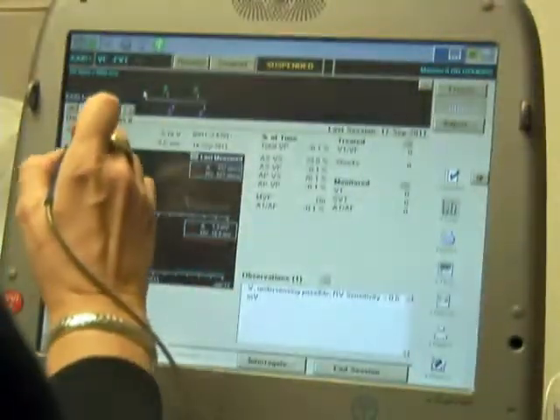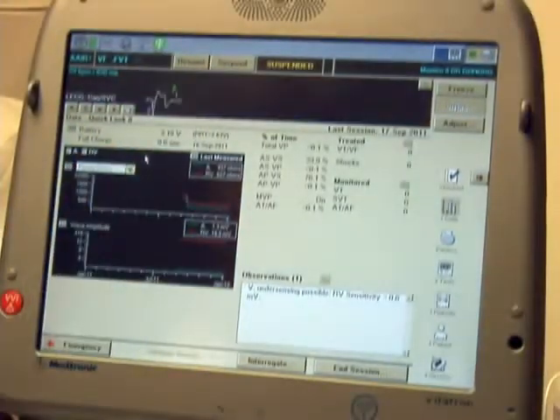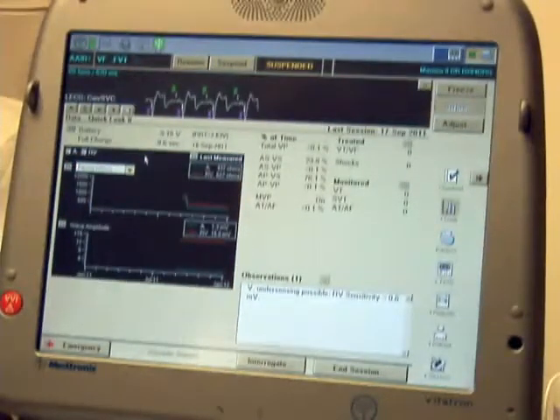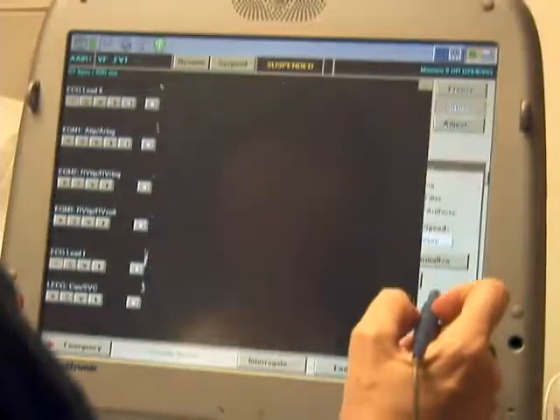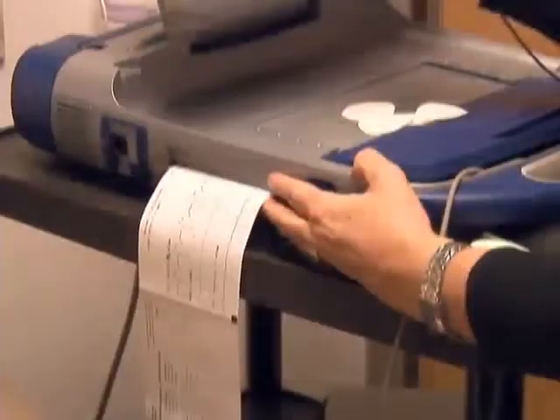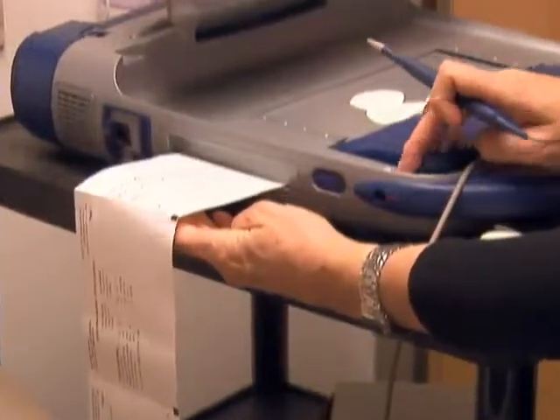This patient has a wireless device, and so the leadless ECG option is selected for viewing the rhythm. Lead 2 is also assessed. The electrograms and marker channel can be adjusted by selecting features under the Adjust button. The real-time presenting rhythm should be printed and examined.